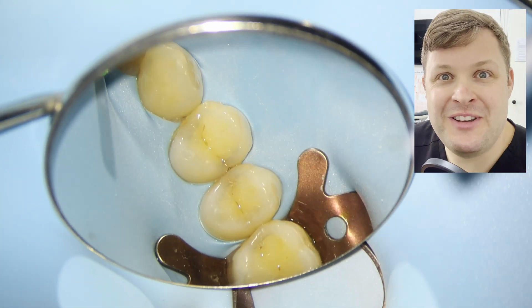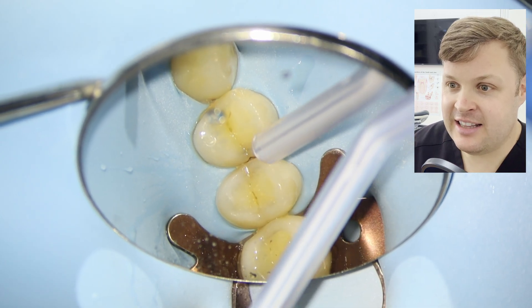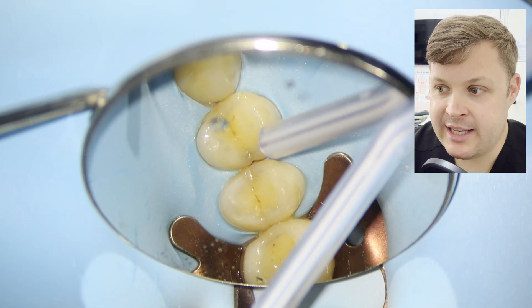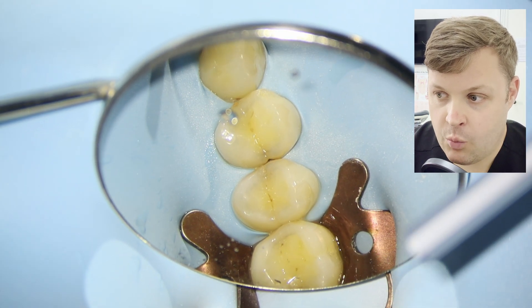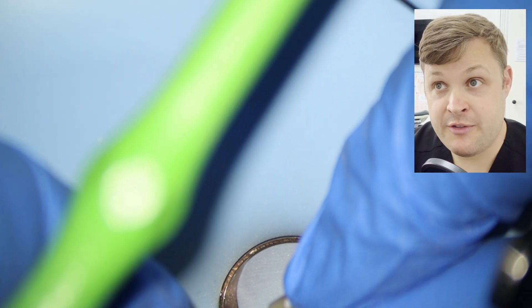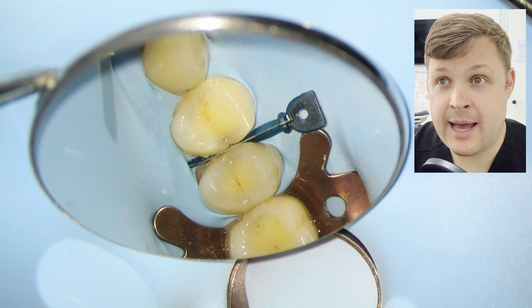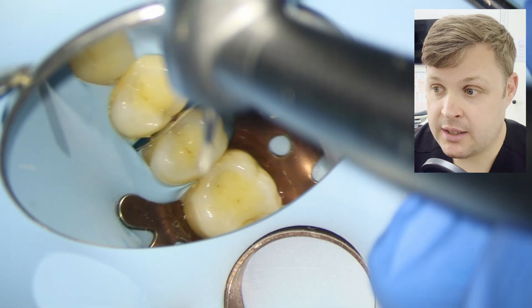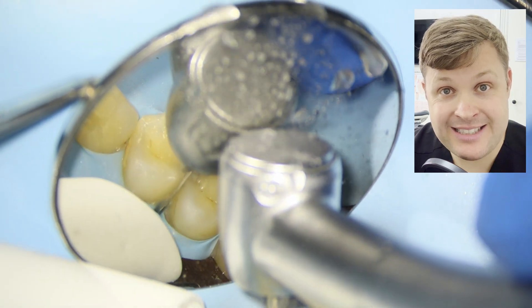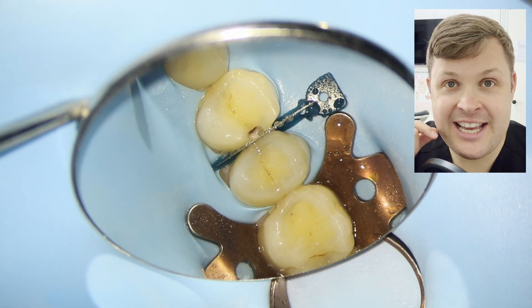Hello, welcome to this video. We're going to show you a neat little trick when doing composite filling when seemingly one surface has decay in it and the adjacent surface doesn't. What can happen is when you're trying to drill one surface, there's a possibility you might damage the tooth next door.